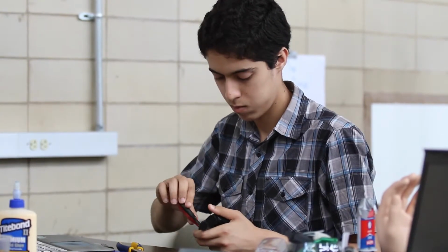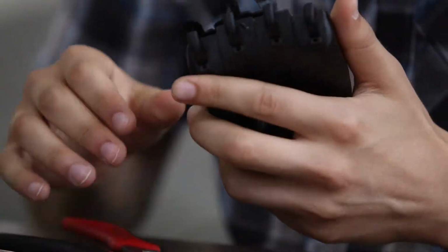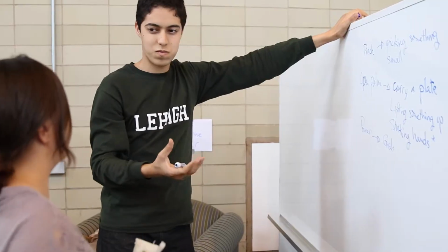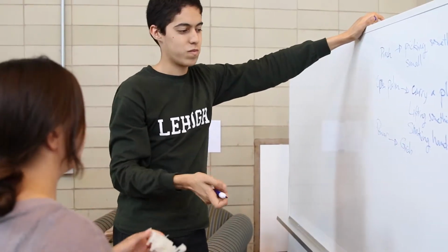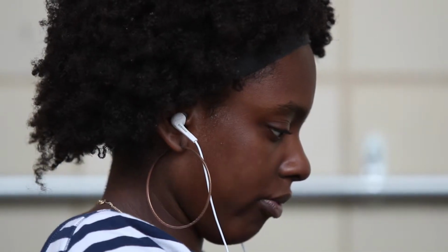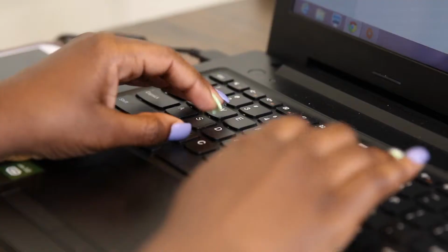Using electronic components makes it much easier and more practical, but we're now using straps, so we're making it body powered. So for example, when you move your shoulder, you move a certain finger of the hand. And the reason for it also being body powered is because we want to drive down the cost a little bit. If we can make an effective body powered hand, we don't have to rely on electronics, which drives up the costs in many, many different ways for prostheses.